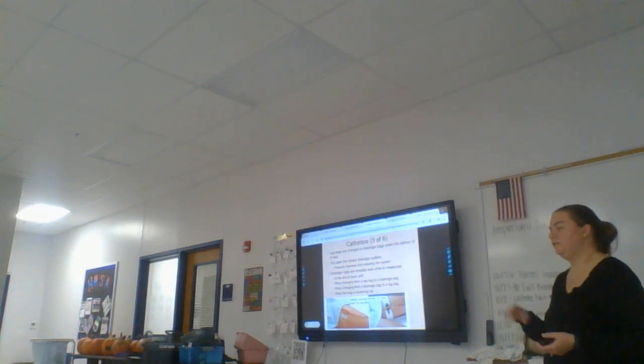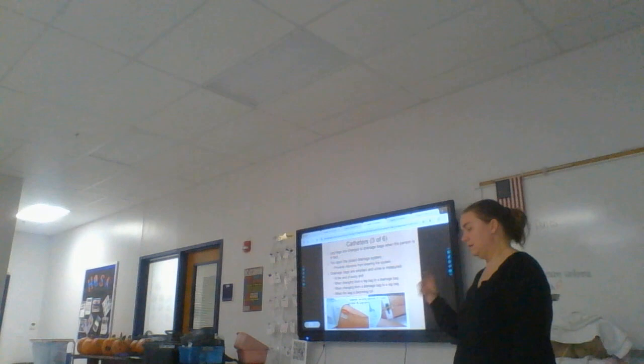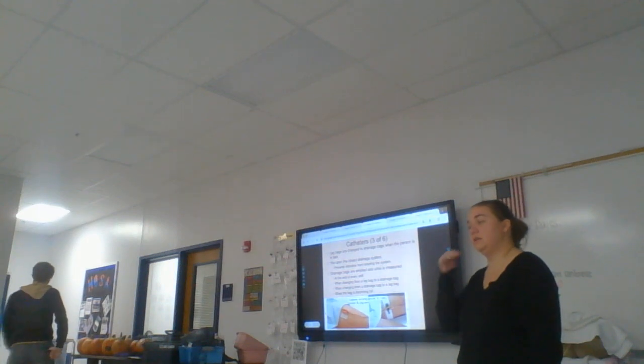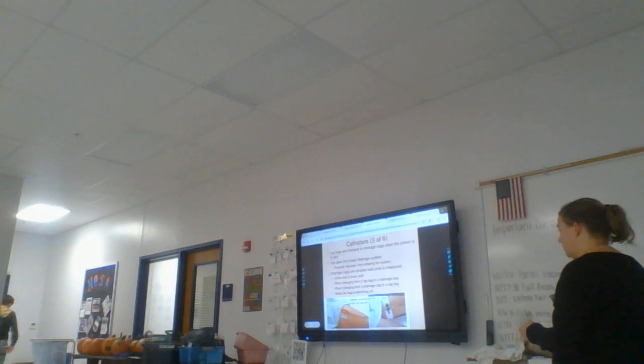Honestly, when you're at clinical, if you're seeing more than a small amount of urine, you can go ahead and record that down, empty the Foley bag, especially if you have to move the patient. Record that amount down and then take it to the nurse to chart, because we actually do not document much at our clinical sites ourselves.